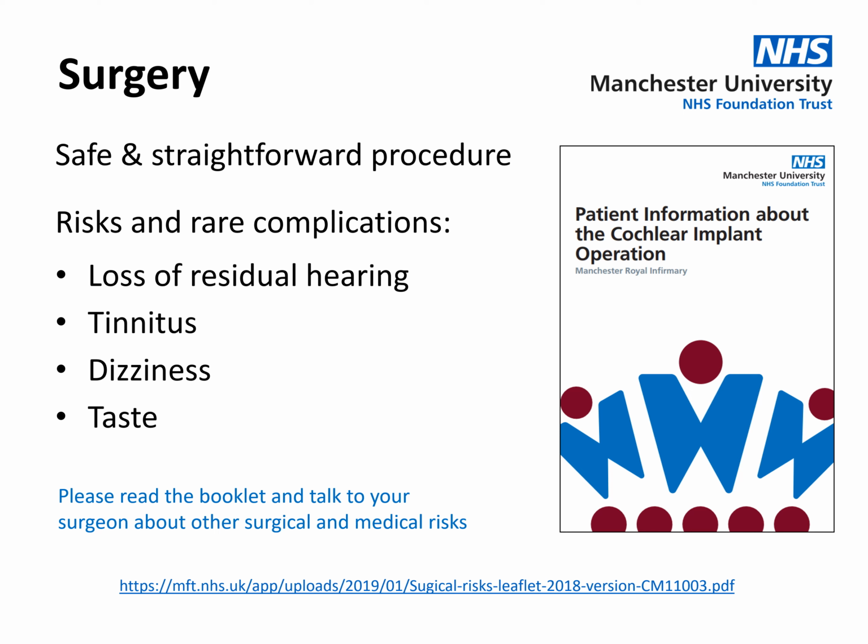Our recent experience has shown that in about half of the patients who have hearing preservation surgery, we can preserve enough natural hearing so that patients are able to use a combination of the cochlear implant and a hearing aid afterwards. The cochlear implant stimulates the high frequency region of the cochlea, and the hearing aid stimulates the low frequency area. This is what we call electroacoustic stimulation.